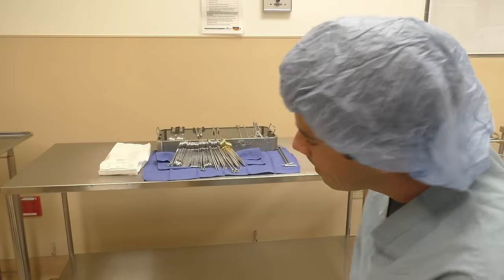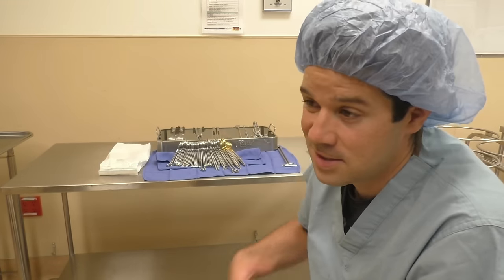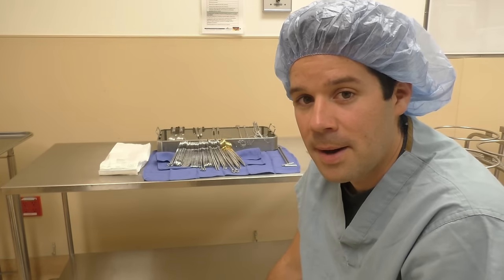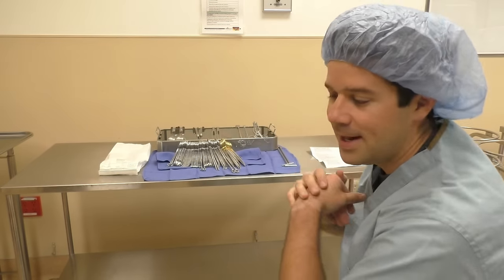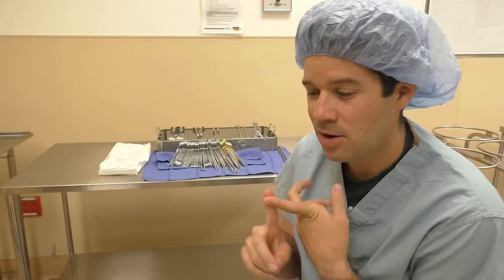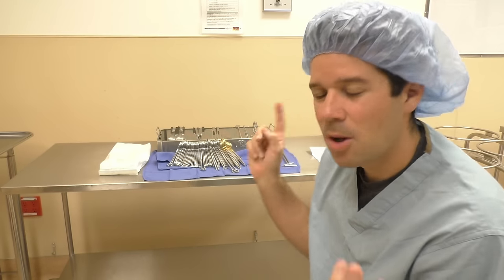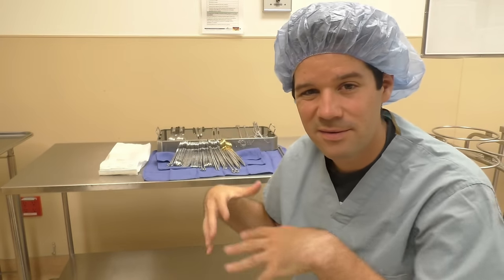So, we're starting with, I think, the simplest tray that we have in the OR, and that is the general minor tray. This is a tray that you're going to open up for any type of minor general procedure. Pretty much all of your hernias, umbilical, inguinals, stuff like that. Small breast cases, like lumps and small masses. Basically, like I&Ds of knees, groins, anything really.